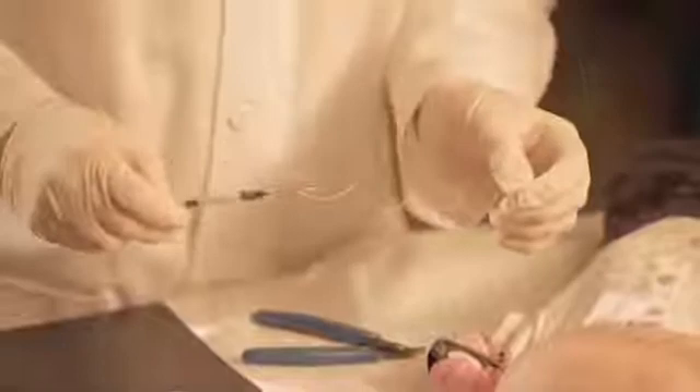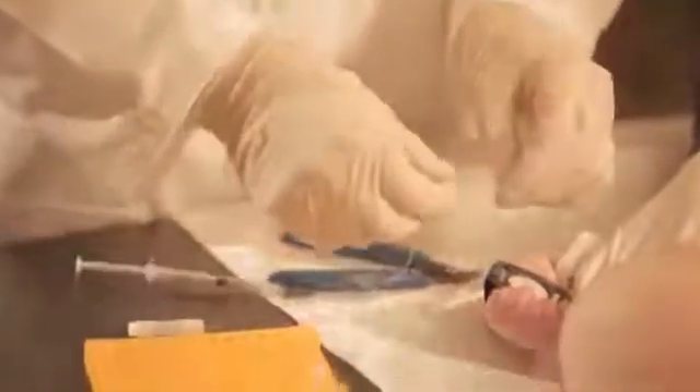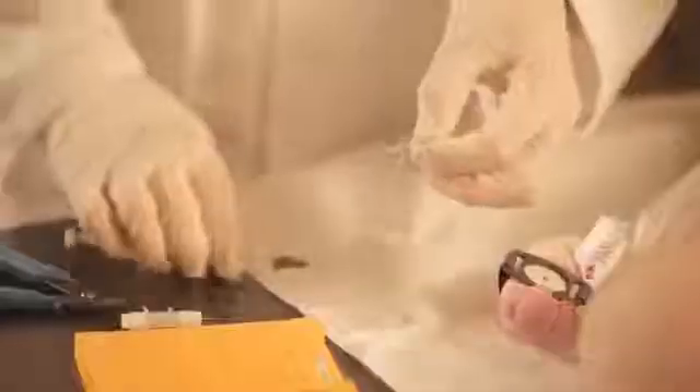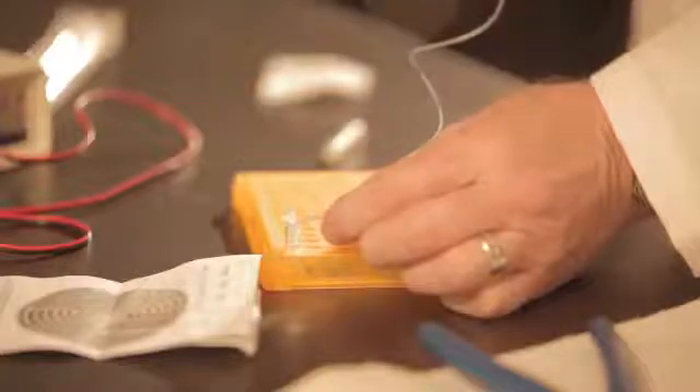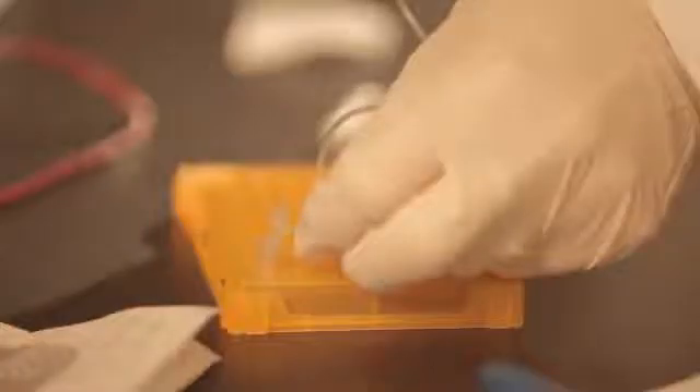Uncoil the collector tube all the way to the center, leaving the center of the tube attached. Use the nipper to cut the tube at the base closest to the center of the collector. If the sweat did not fill the collector tube entirely, slowly pull back the sweat about one inch. If the sweat filled the tube entirely, do not pull back. Use the nipper to cut the end of the tube back about 0.5 centimeters to reduce the curve. Put the tip of the tube into the small sealable container provided with each kit.